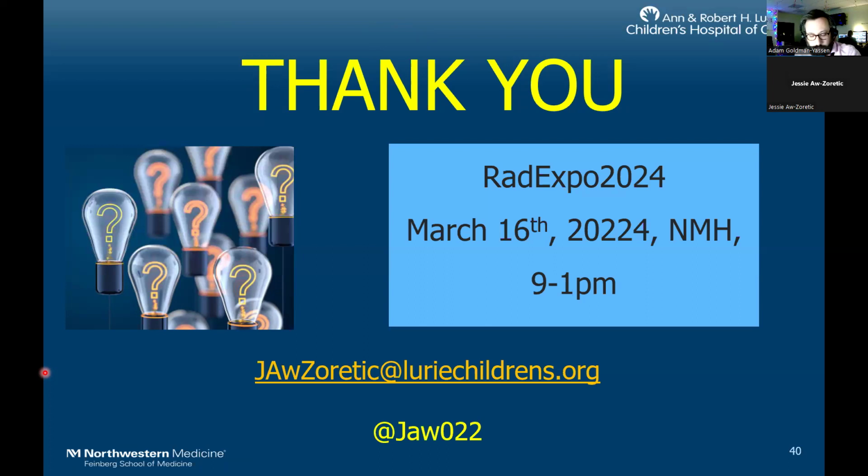So I spend quite a while going through the notes with these cases. It's kind of gold dust. It just says they dropped ASL from their neonatal brain protocol. So it seems like there's a certain number of ASL neonatal protocols. When one person adds it, the other person drops it.